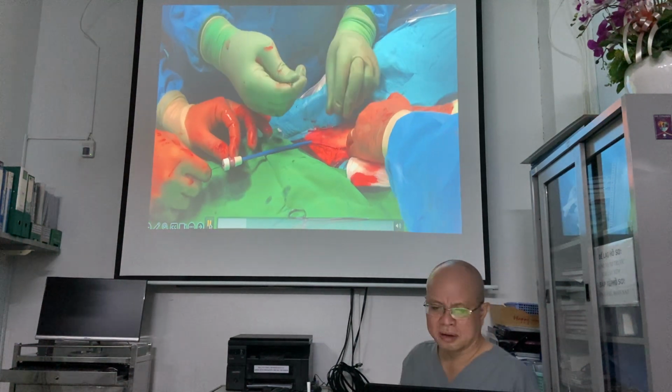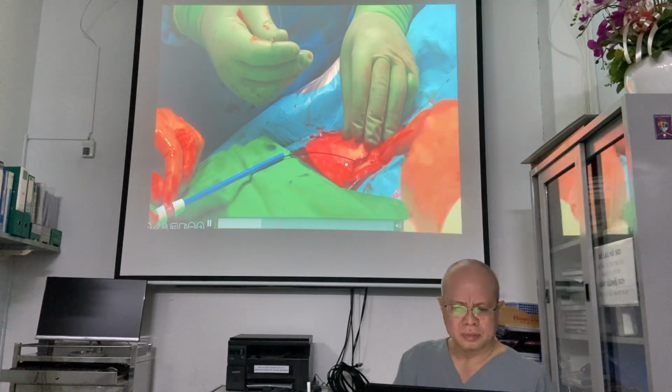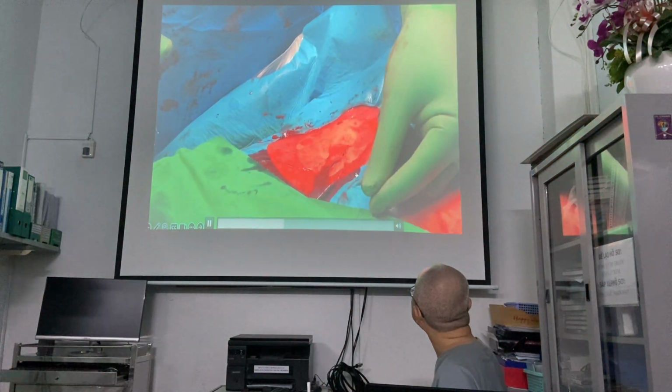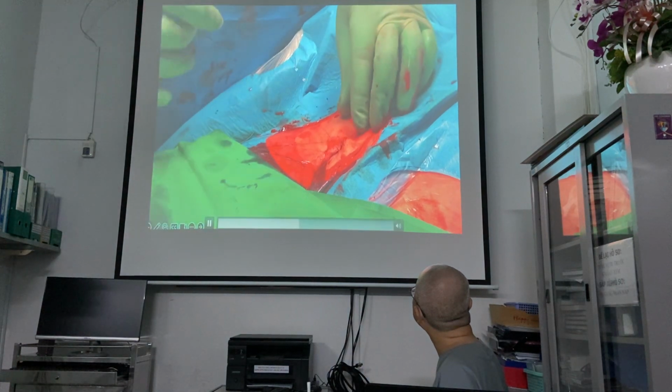Look carefully. They put the wire by accident. Look now. You have to leave it in, and then they pull it out. Look. No, they pull it out. They make a mistake. Never do this, yeah. You have to leave it in, yeah. And you see the suture is there.